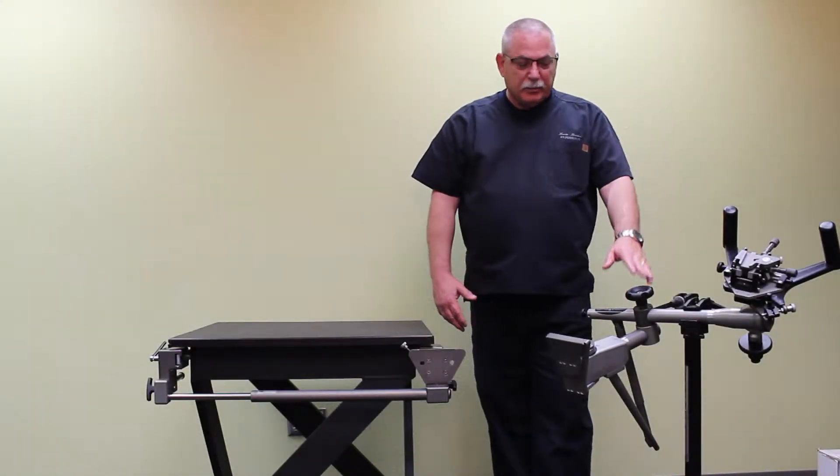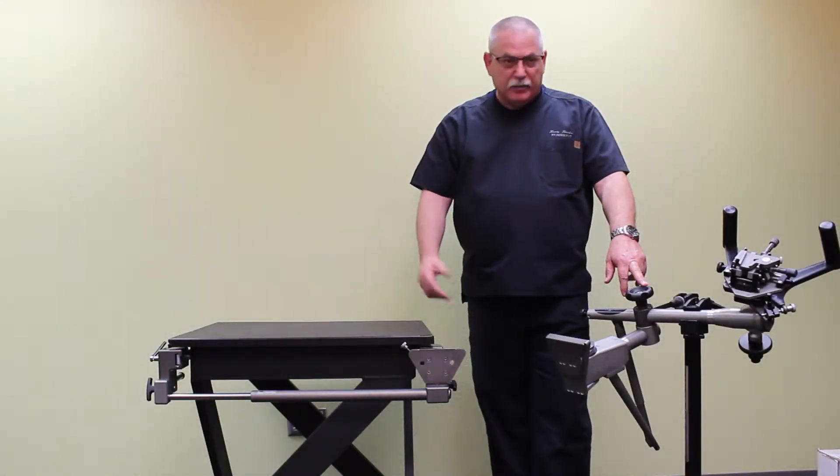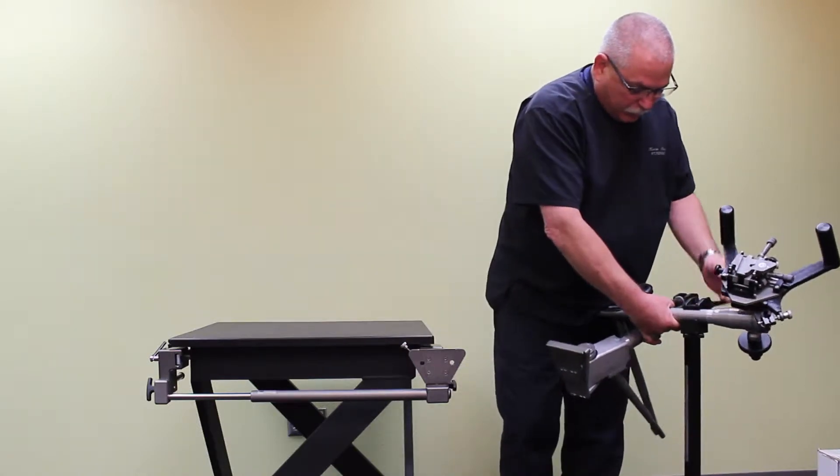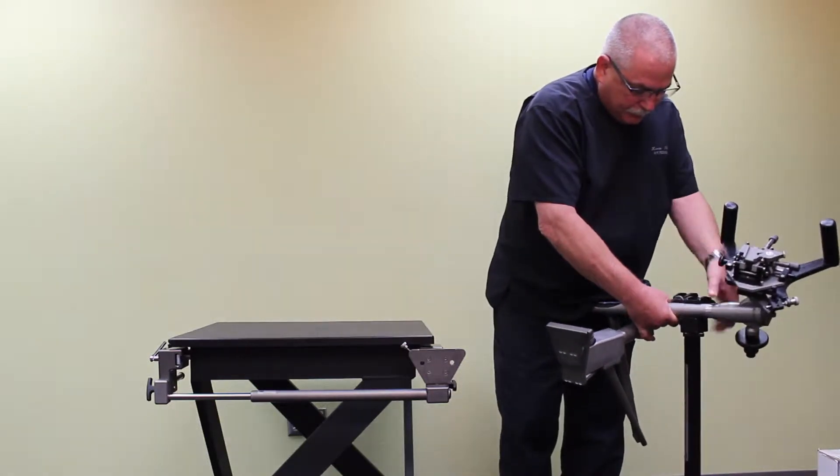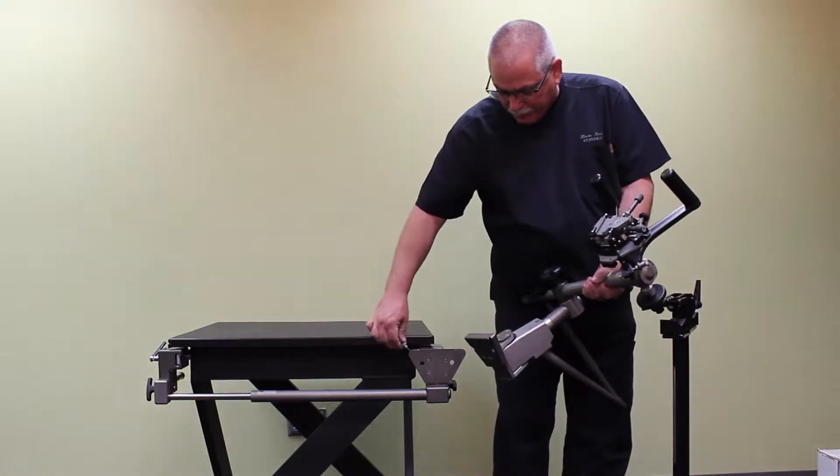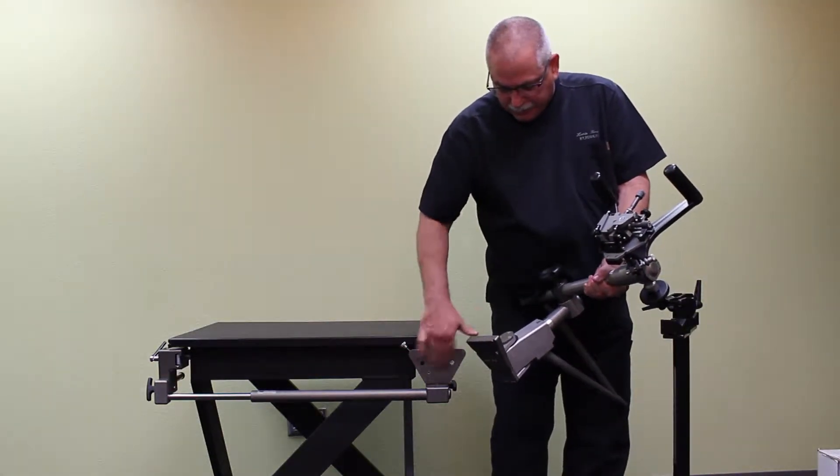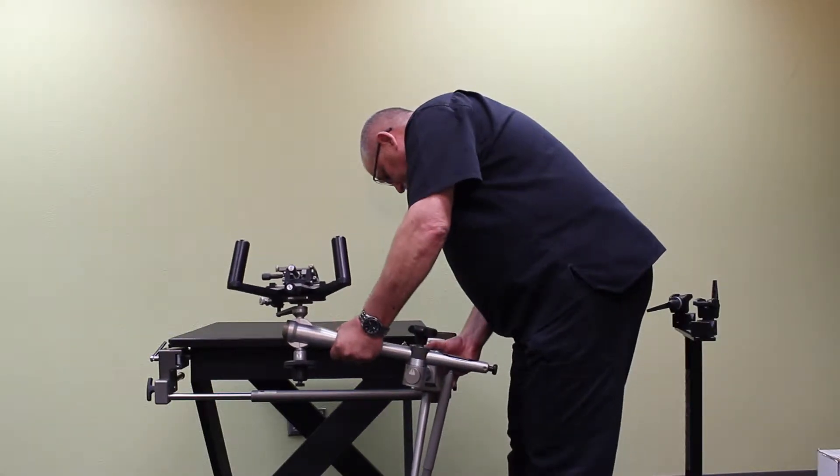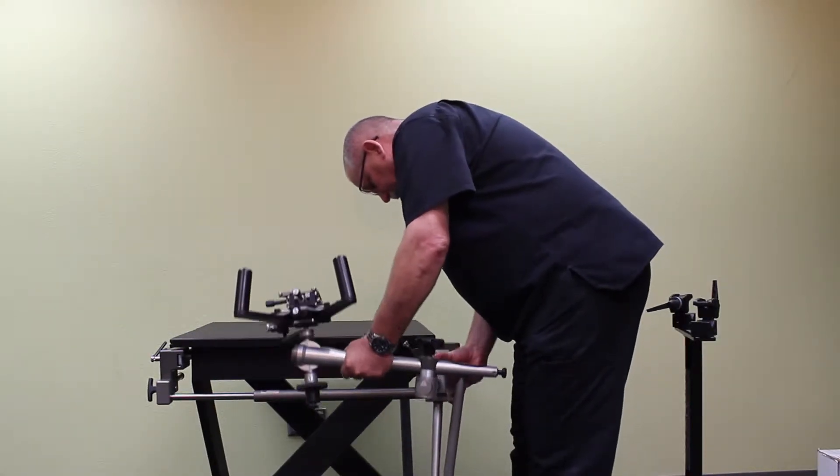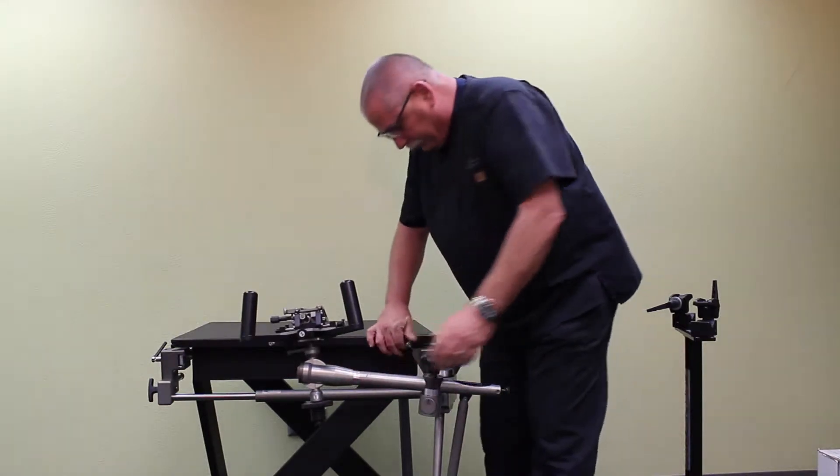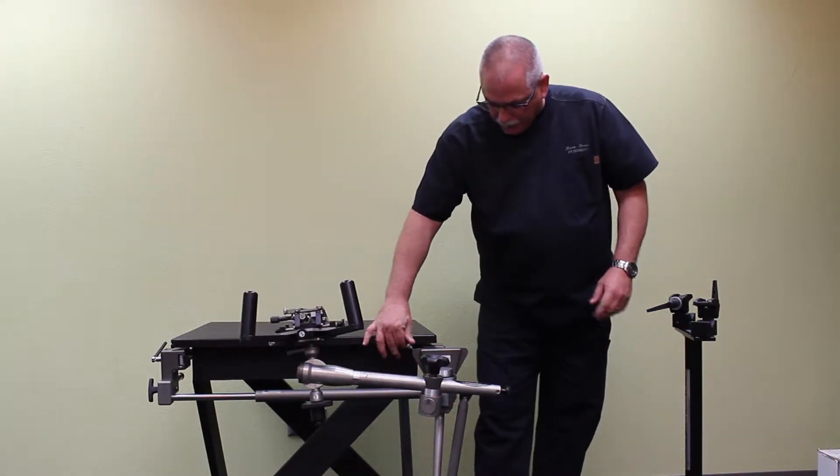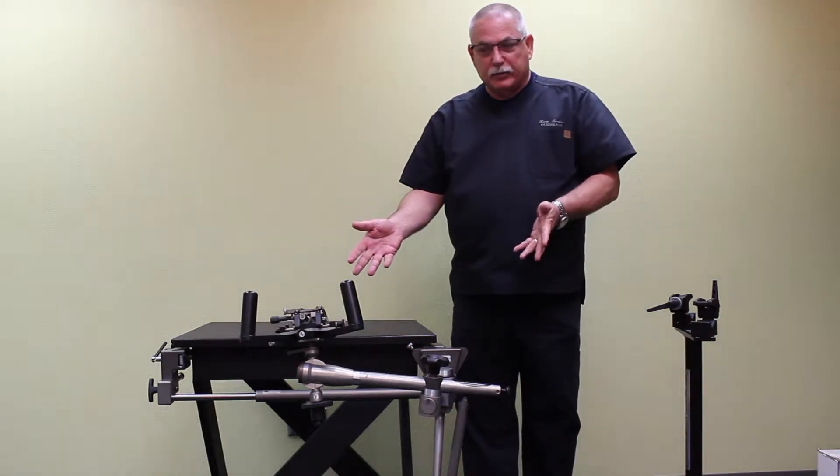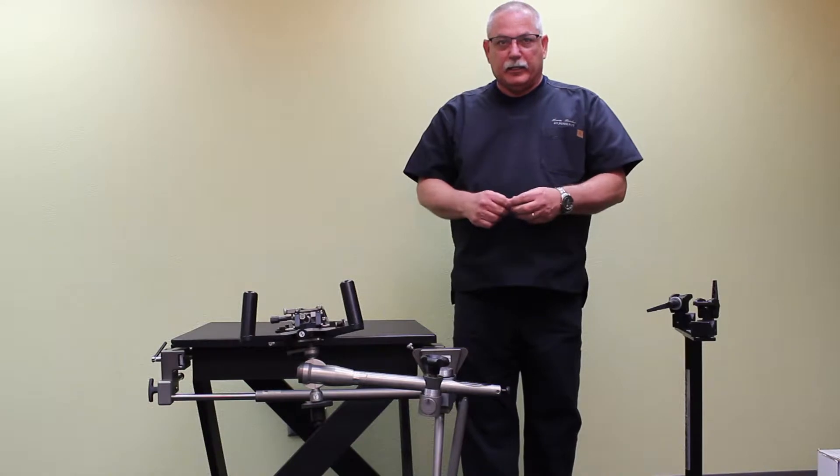Next, we're going to attach the micro touch stabilizer onto the table mount. I have it on the transportation stand. I'll remove it from there. I've loosened this knob to allow this plate to fit down into this plate. Now I'm tightening the knob here, and my micro touch stabilizer is attached to the table and ready to use.